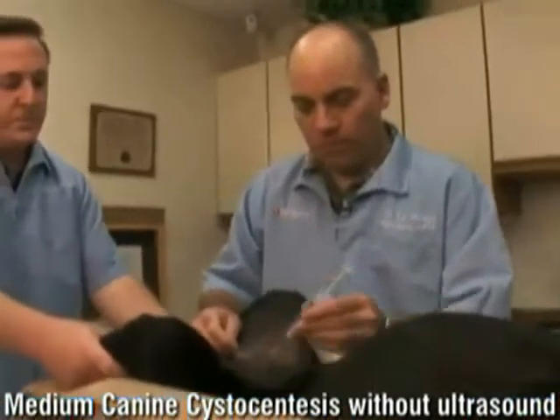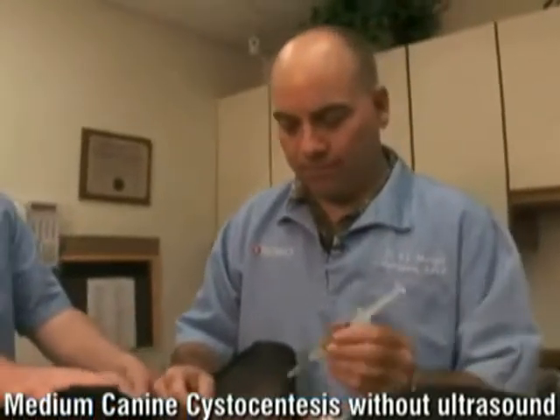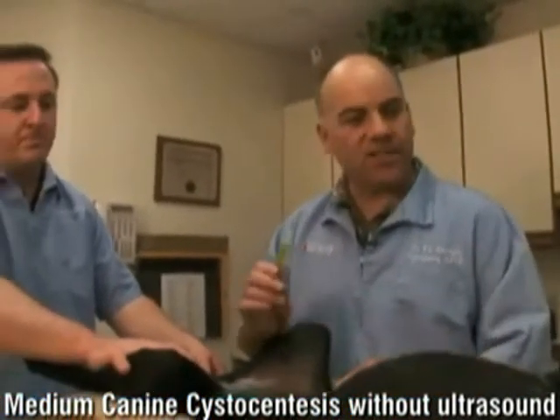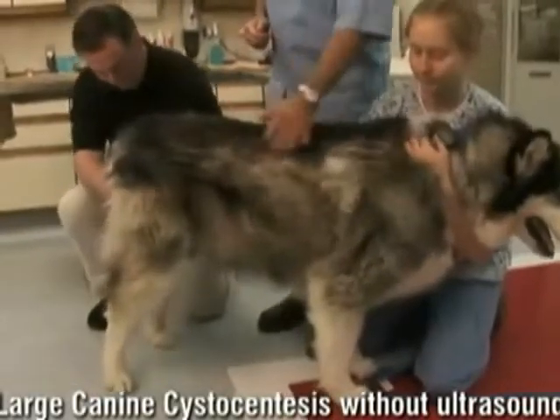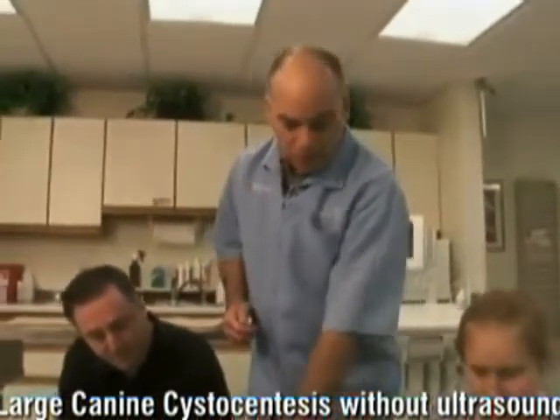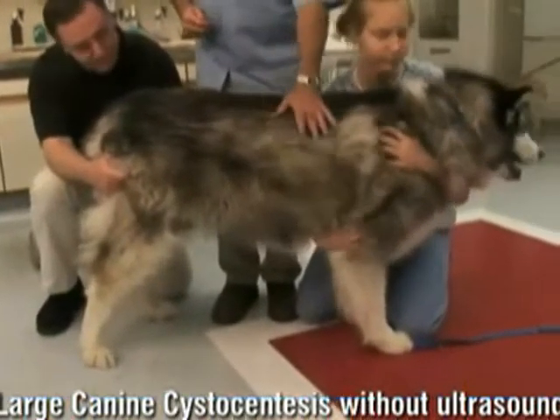If you don't get urine the first time, one thing you don't want to do is move the needle, because you could do some damage to the bladder or maybe even other structures. If we go in and don't get any urine, what I did when she jumped is I just backed up a little bit — and that's when the urine flowed. If we don't get a sample, we pull out and can try one or two more sticks, as long as we're not moving the end of the syringe around. After that, I would ask owners to bring a urine sample. With these cystocentesis techniques, it's pretty easy to get urine on most dogs.